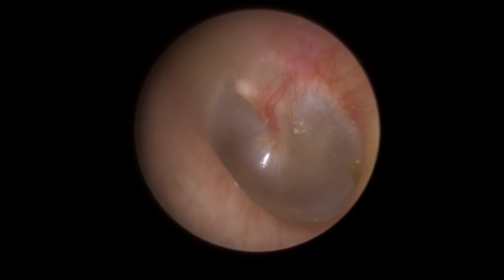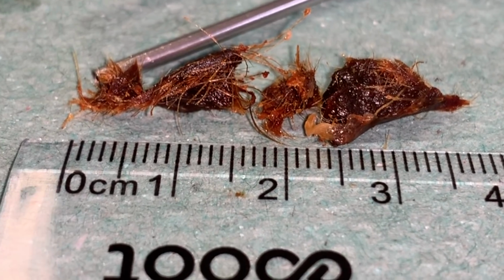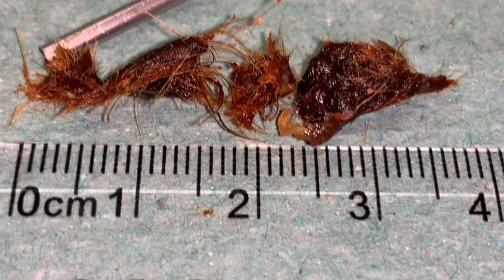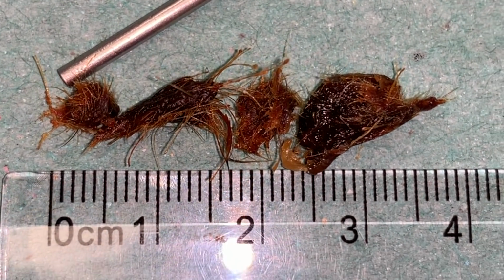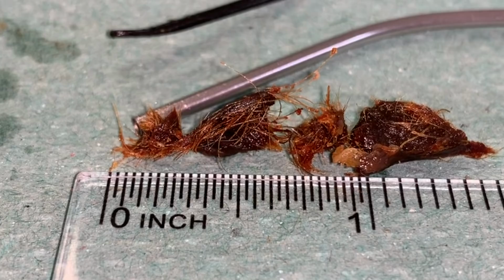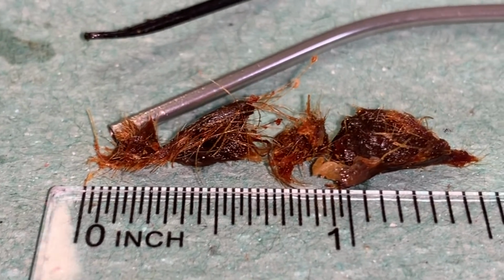Here we are, you can see the eardrums looking nice and healthy on that side. Some waxes call for different types of tools, so we do favour some over the others. You can see all the hair embedded in the very, very hairy wax. That's why it was difficult to remove, because it was really bound together.